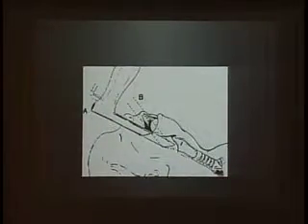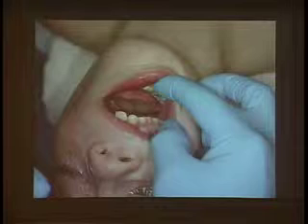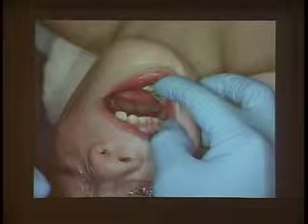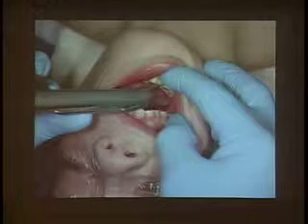I found this in Sylvan's line drawings from one of the old ENT things, and actually there's his rigid laryngoscope, and it's very clear that it's on the side of the tongue. I mean, he wasn't conscious that this was even happening. So I'm trying to do this. I don't have a good video, so there's a couple stills, and this is a normal patient. But what's impressive is if you have one where you can't do anything and you get a view, that's where it's really impressive.